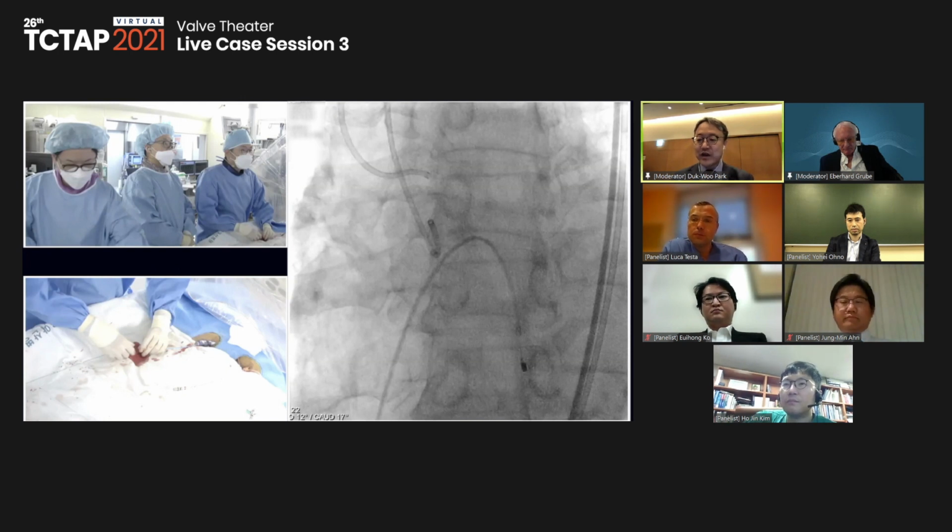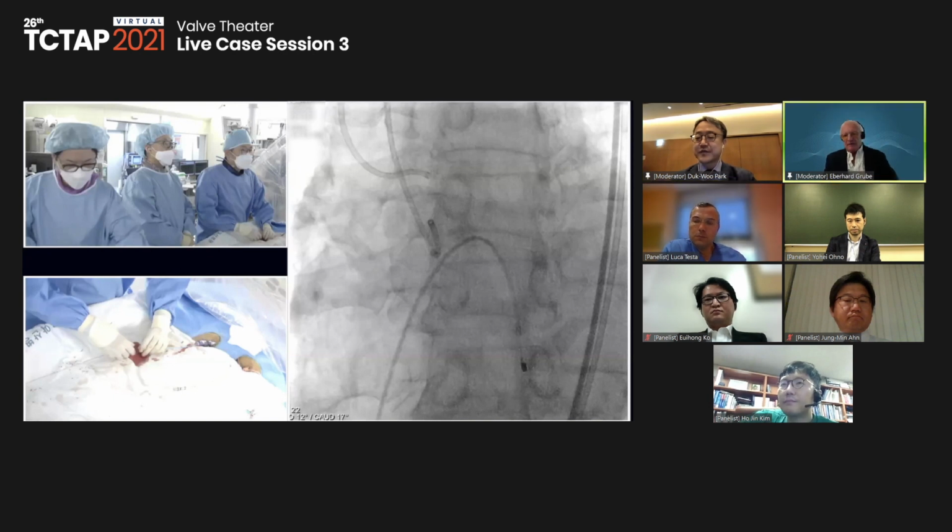Now we are combining MRI plus 3D echocardiography, and we usually follow MRI measurements more strictly, but it's not as good as CT angio. How do you think about patients having renal insufficiency? In my opinion, it's probably a matter of experience with 3D echo.